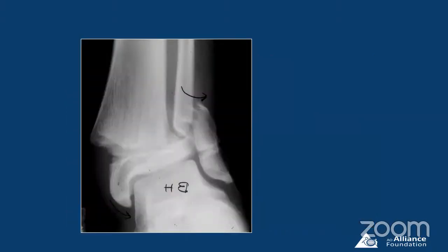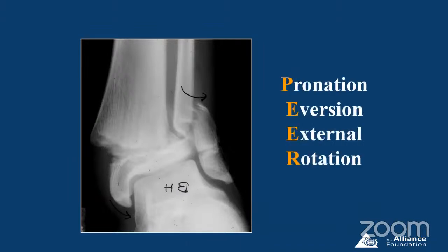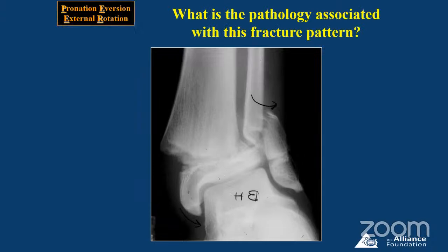So let's move from this SI injury to something that is called PER, pronation, eversion, external rotation. This is pattern 2 in the ankle injuries. Now you can look at this X-ray and tell me the fibular fracture is always metadiaphyseal. It is not epiphyseal. And the tibial fracture is always Salter 2. Okay. And the foot alignment is always valgus. Okay. So just by looking at the position of the foot, you can tell what injury this is.